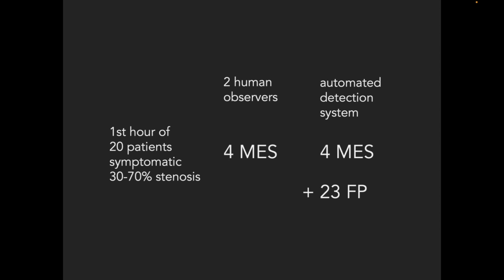The system, however, offers the possibility to manually evaluate all possible microembolic signals according to the automatic detection system. The possible microembolic signal is then embedded in short segments of Doppler signal, which means that a human reanalysis of these segments can be done within a short time.